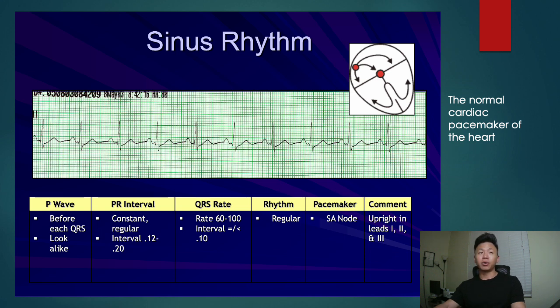All right, so when we talk about sinus rhythm, I want you to take that word, as we discussed in part one, your sinoatrial node. I want you to take that word sinus and look at this tiny photo right here. The first red portion is your sinoatrial node, your SA node, and it leads up to your AV node. So when we say sinus, the electrical conduction is stemming or coming from that SA node.